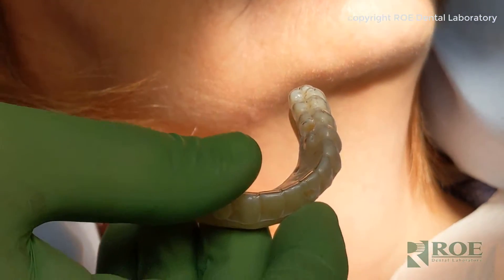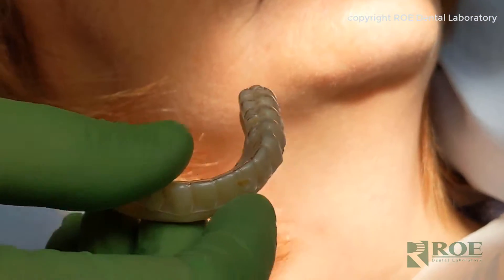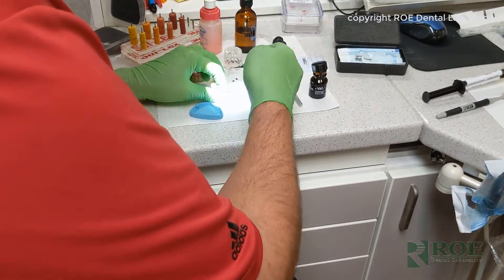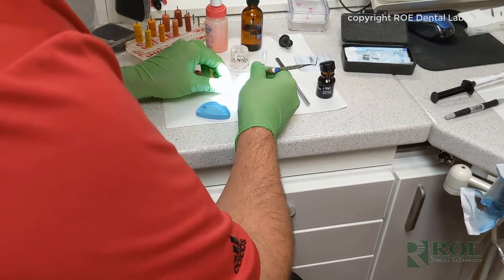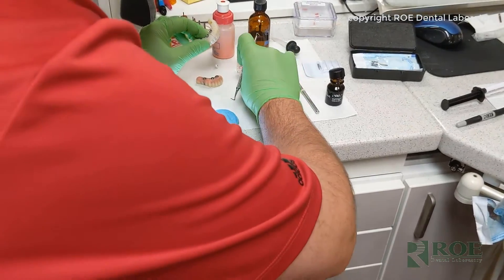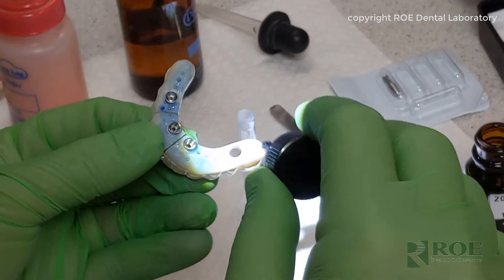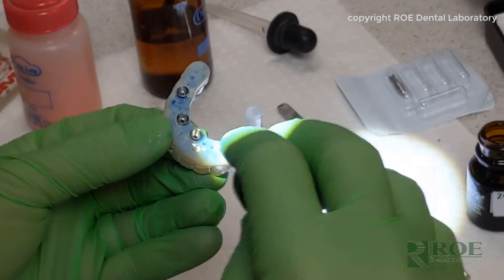What I would suggest is putting a little tray adhesive on the intaglio of it, because we're going to do a reline impression. We want the impression material to adhere — applying some tray adhesive just to the intaglio for the reline.